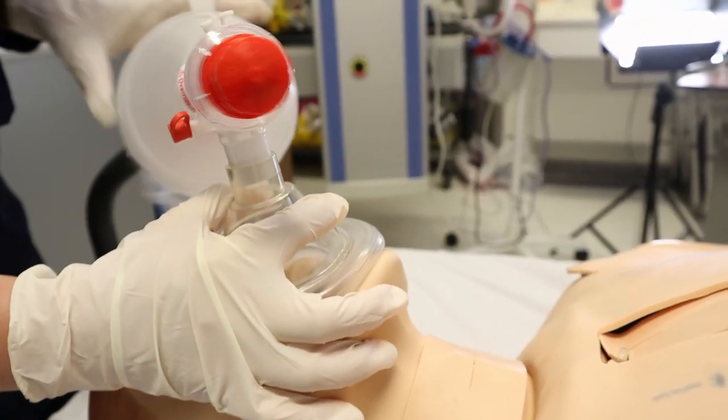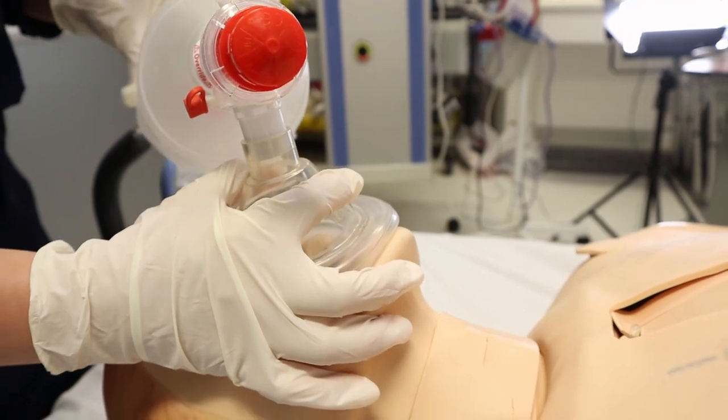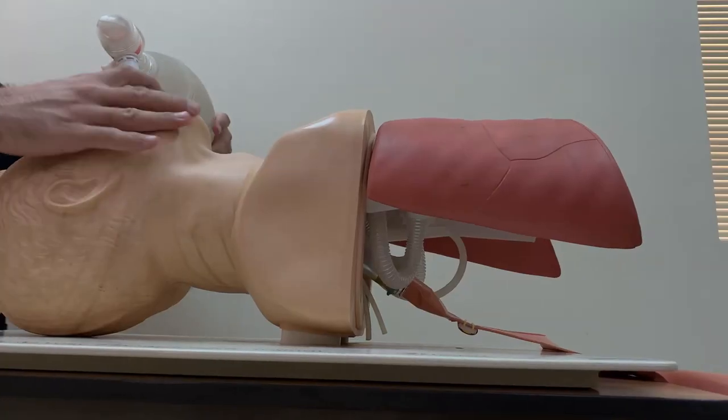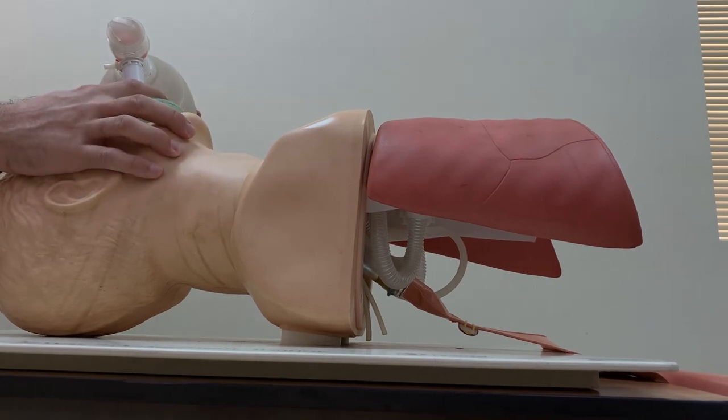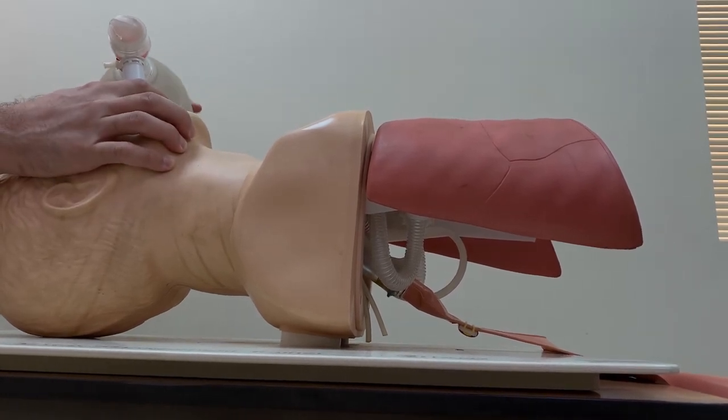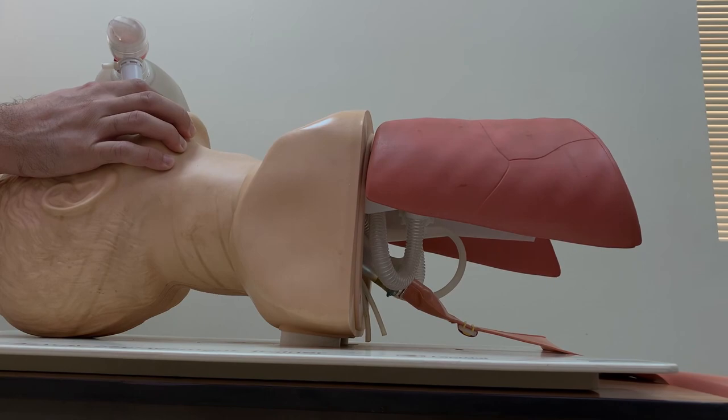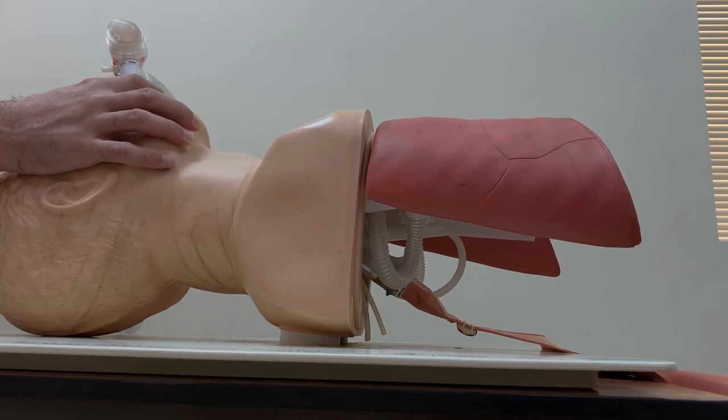We need to observe symmetrical rise and fall of the chest. We can ask somebody to auscultate the breathing equally for the two lungs. You can also use the Ambo bag for the endotracheal tube.